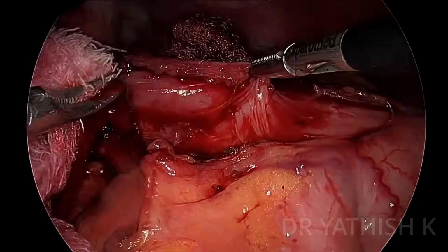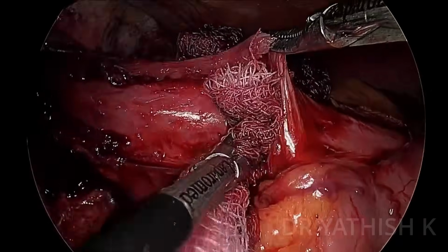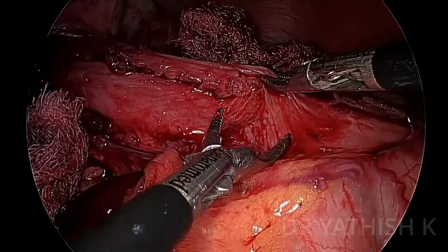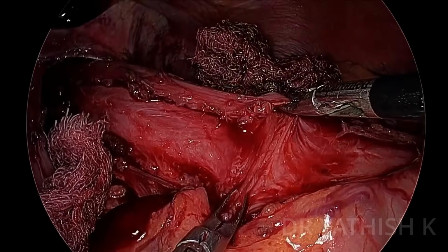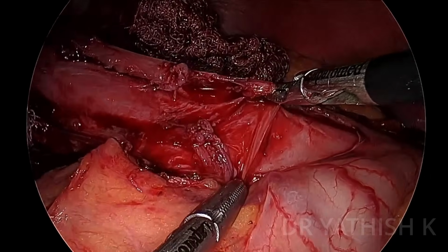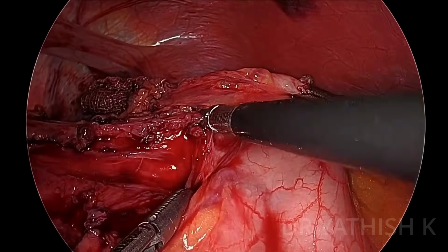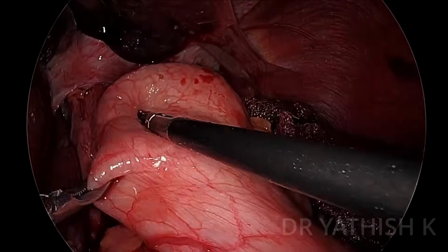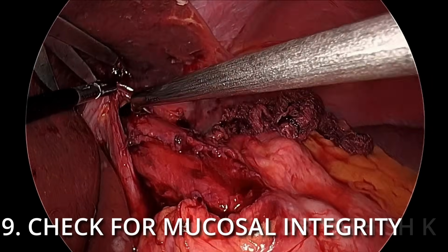So I'm just doing the cardiomyotomy where we can see the circular fibers of the stomach coming into play. So again, you'll have your left hepatic artery in close proximity here, which you have to be more careful of. And second thing, your anterior vagus. I forgot to tell you. So when you do the cardiomyotomy, always make sure to keep an eye on your anterior vagus so as not to disrupt it. And one more trick here, you can see my assistant is pulling the fundus to either side, in such a way that he keeps the lower esophagus in tension.